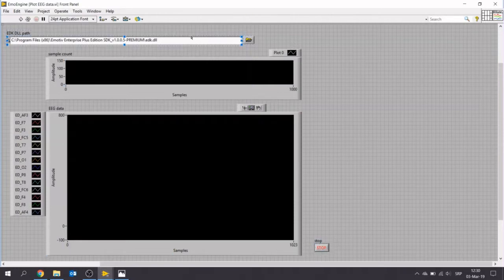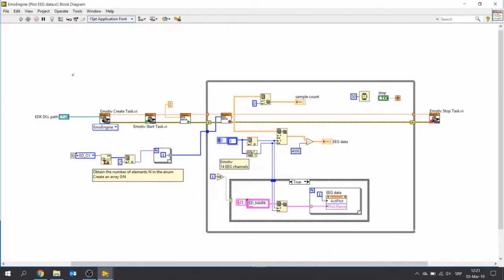This control specifies the path to EDK file that we have to communicate with the device we have. This graph shows sample count in our EEG signal that we acquired, and this graph here shows us all EEG signals from all the electrodes we have chosen. After we saw how a front panel looks like, let's see how block diagram looks like. At first look, we can see that this structure is very similar to structure for basic data acquisition.